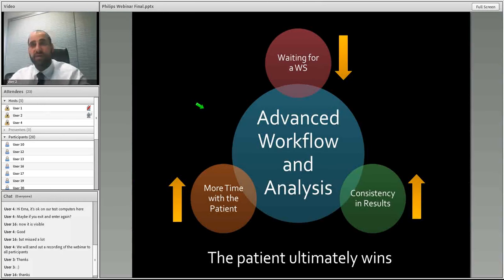So ultimately, when we're looking at advanced processing, at radiological information and imaging, and at where we fit in the holistic approach in the patient's life cycle, from birth to death, from treatment to detection, from diagnosis to outcome, it's all about time. It's all about access to information. If you have a look at this screen here, I don't need to wait for a workstation anymore, because I like to look at CT, MR, PET, PET-CT, PET-MR, ultrasound.